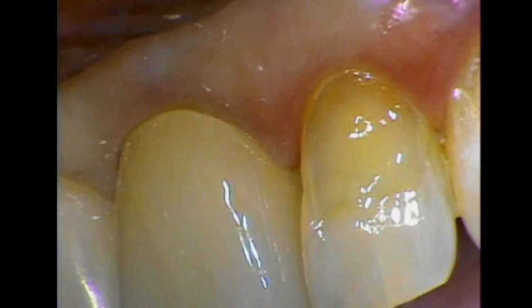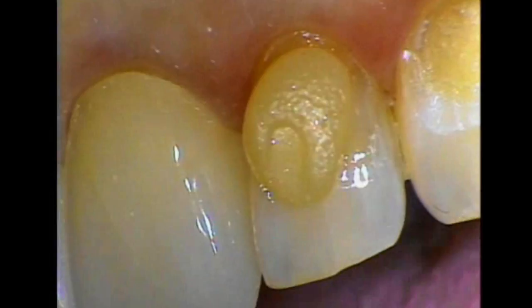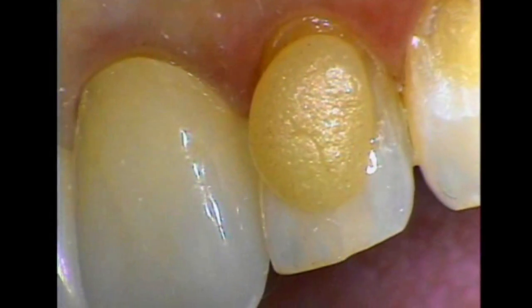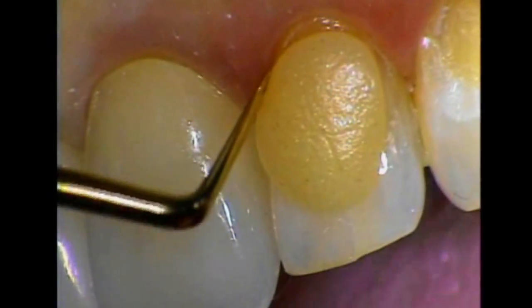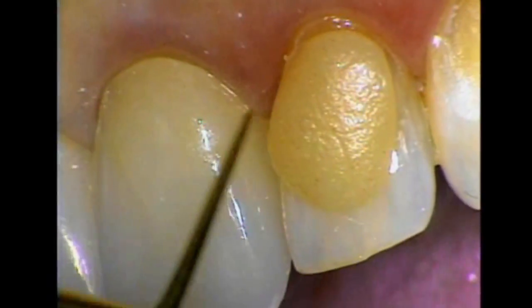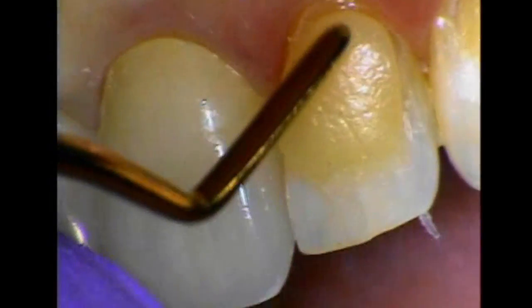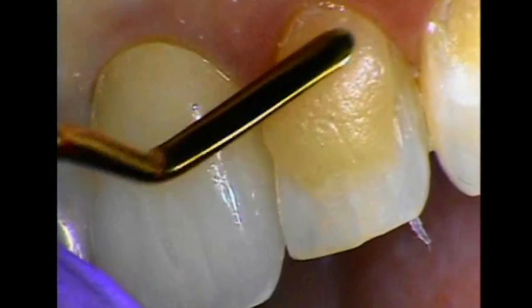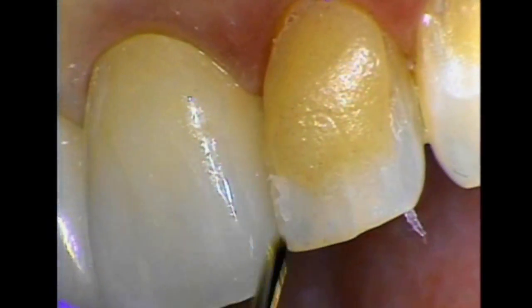I put it in a roll of convenience form — you can look at the end of it — and I use my fingers all the time. I'm just going to apply the material and put it in place. I can mold it, I can shape it. Your gloves are clean and dry with no powder — that does not contaminate the material. You don't have to worry about that; it is a myth. You can touch this material all you want, nothing's going to happen.